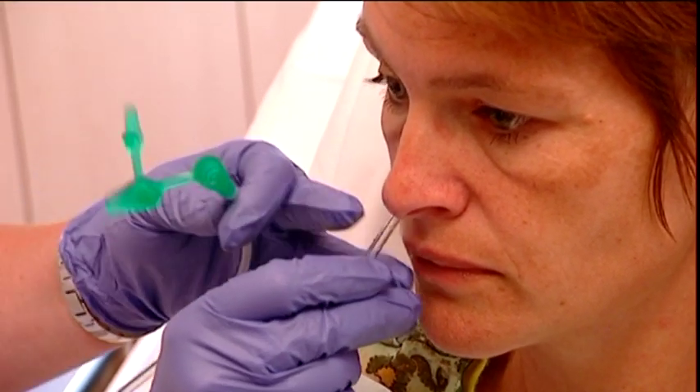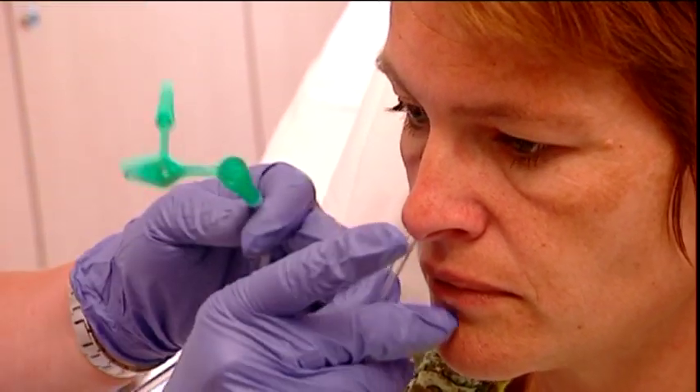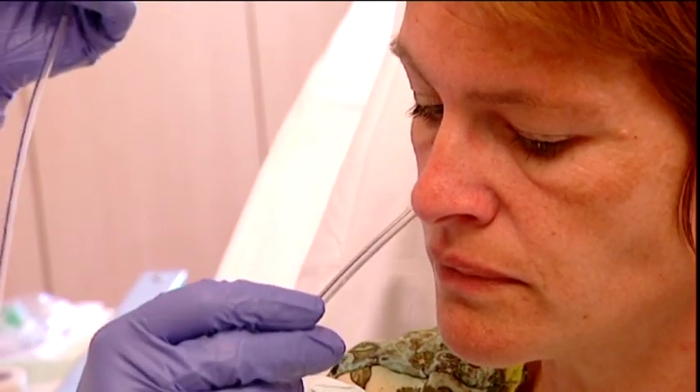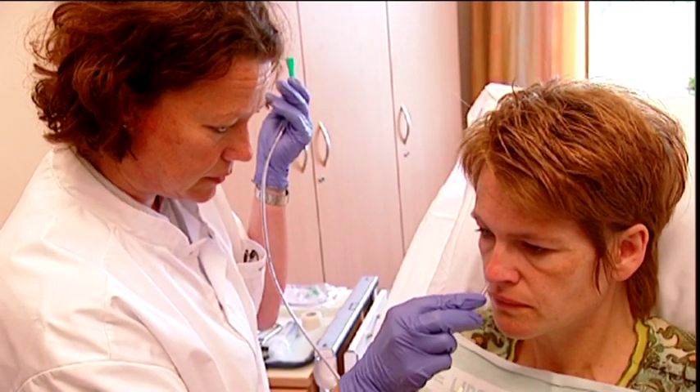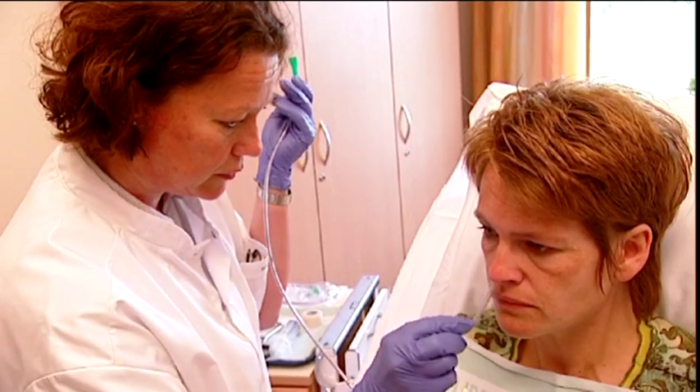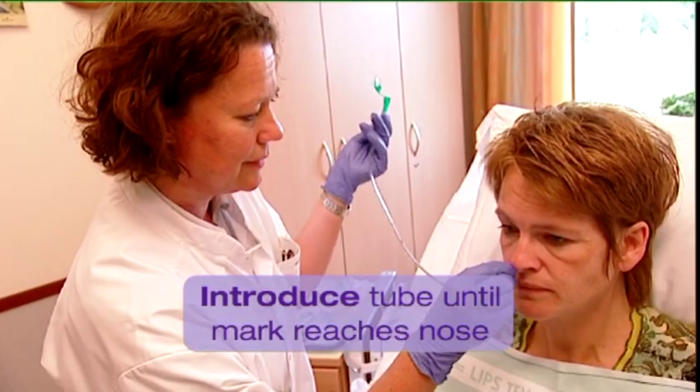Ask the patient to bend his head backwards and introduce the tube into the chosen nostril. Ask the patient to bend forwards as soon as he feels the tube in his throat. Advance the tube further and ask the patient to swallow the tube further down, potentially by drinking small sips of water. Let the patient sigh deeply to prevent retching. Introduce the tube further until the previously applied mark reaches the nose.